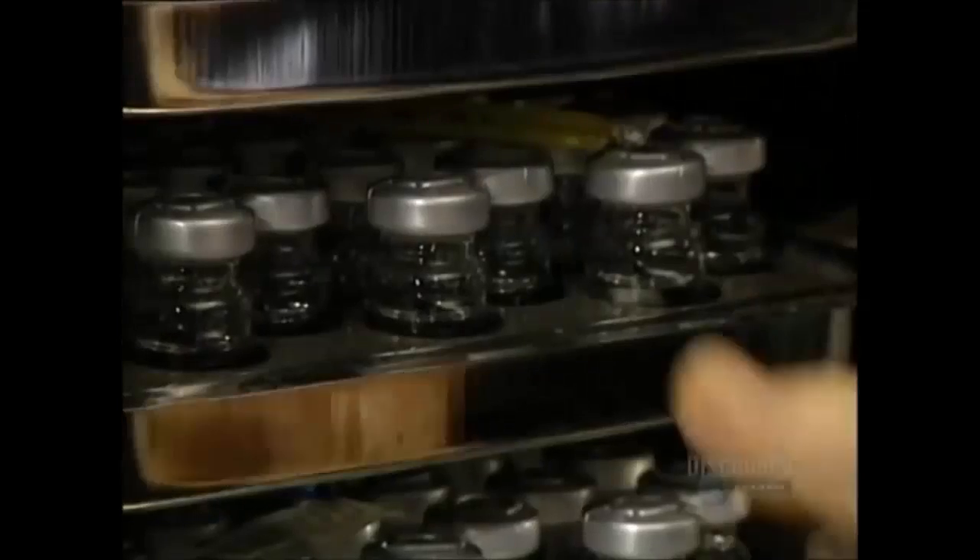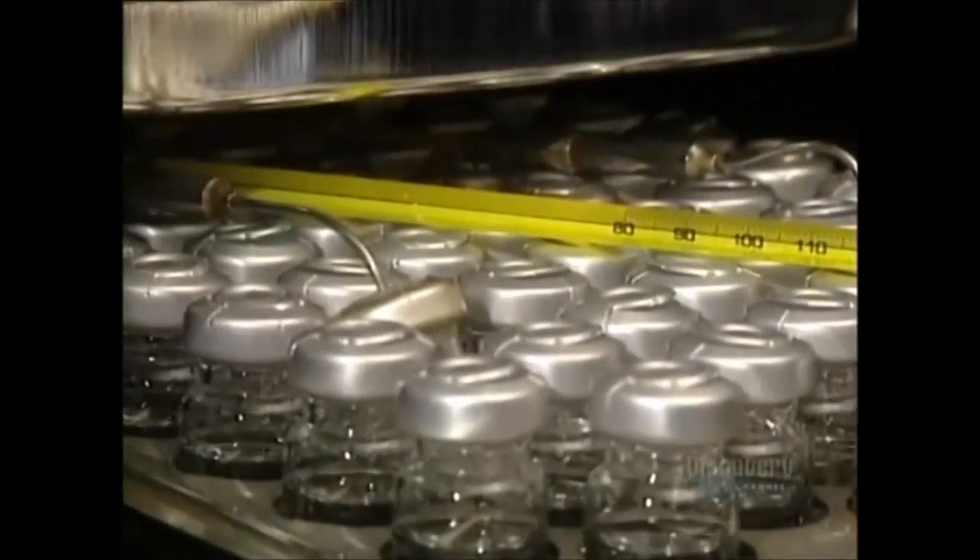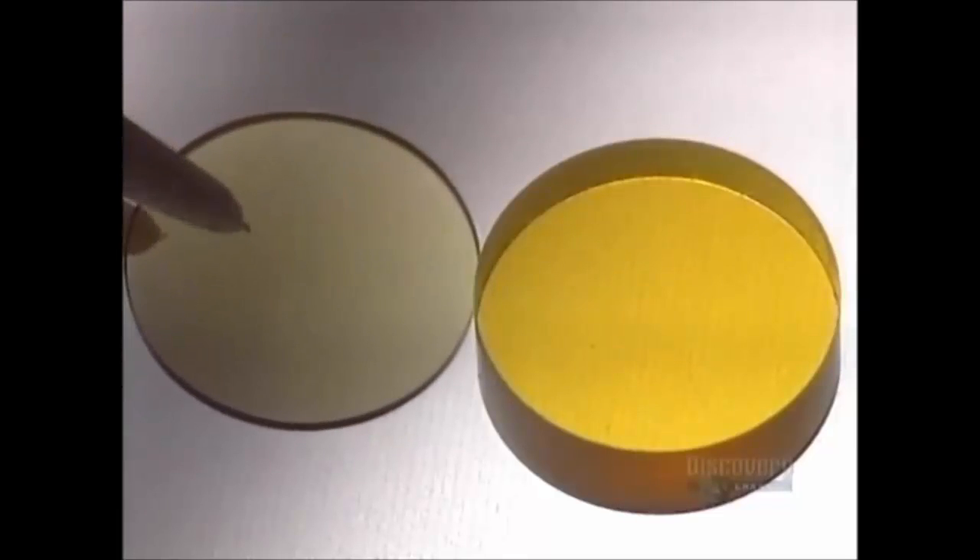These vials are placed in a sterilizer at a temperature of 121 degrees centigrade for an hour and a half. The contents will remain sterile for a period of up to seven years if not opened.